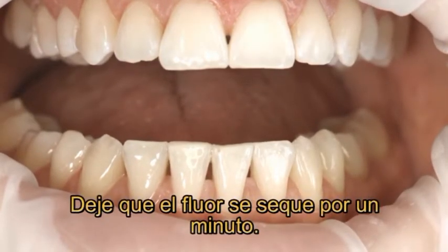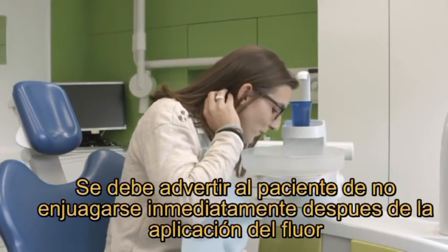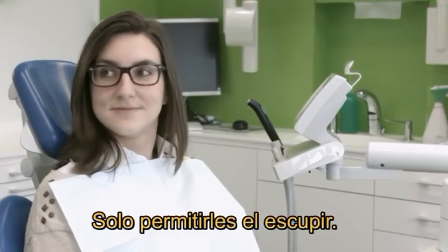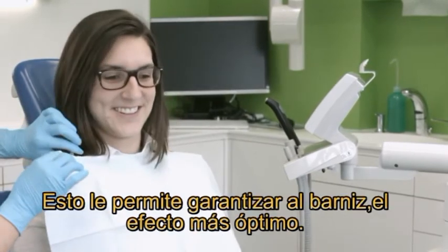Let the varnish dry for one minute. Our tip: do not ask your patients to rinse immediately after the application of the fluoride varnish — only ask them to spit out. Patients should refrain from eating and drinking for one hour. This enables the varnish to take best effect.